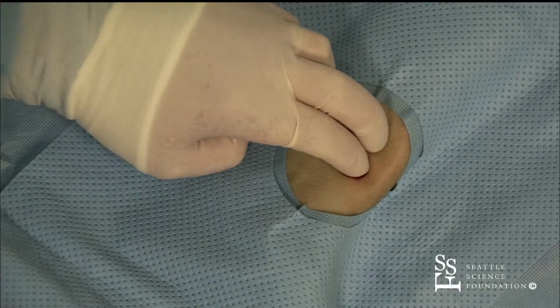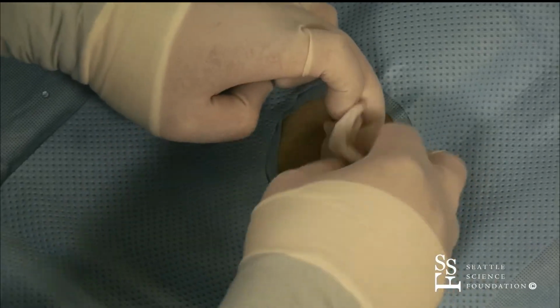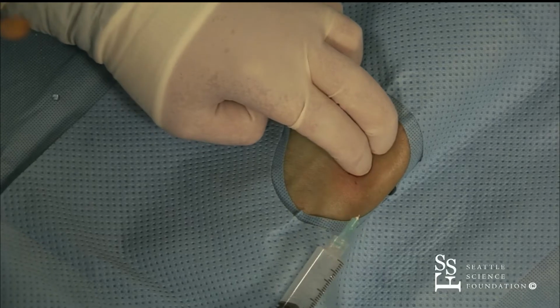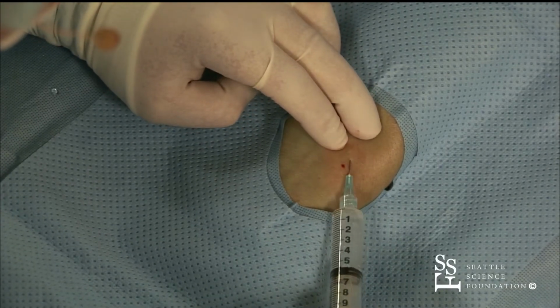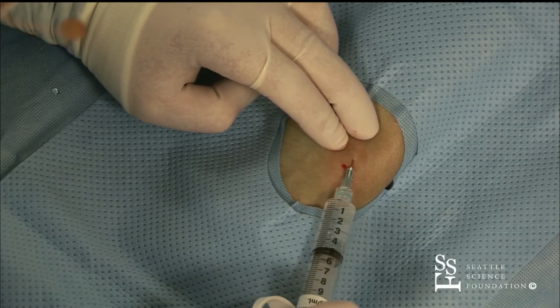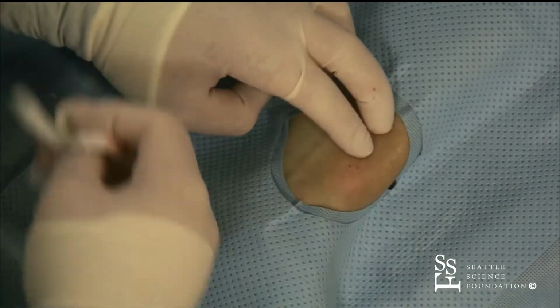Okay, sorry. All right. So I didn't hit it right off the bat here, so maybe I should have done what you said, Jeff. And he's still a little bit uncomfortable there, so we're going to numb him up a little bit more. So the other technique we'll talk about mainly tomorrow is sonosite.